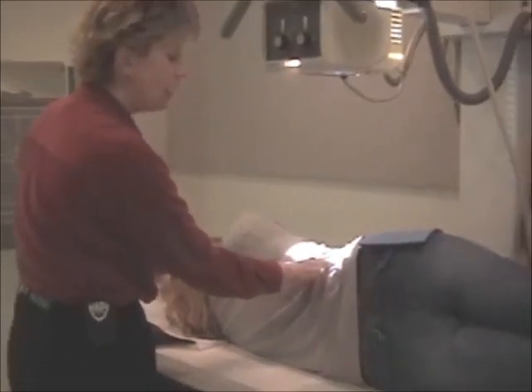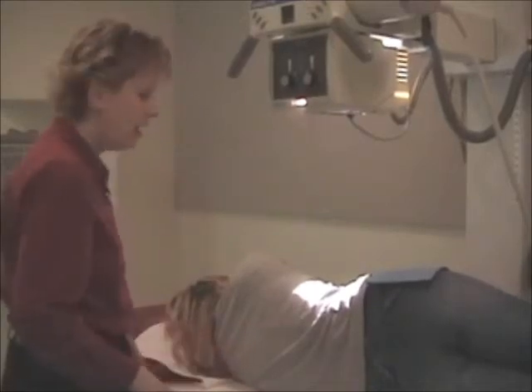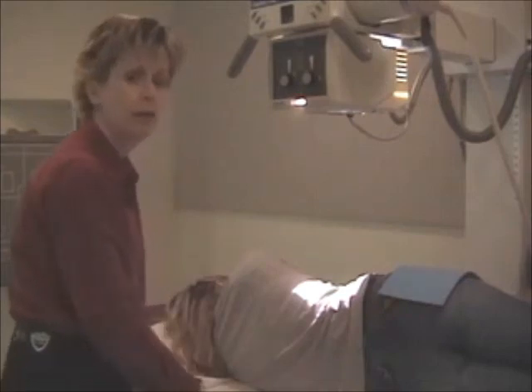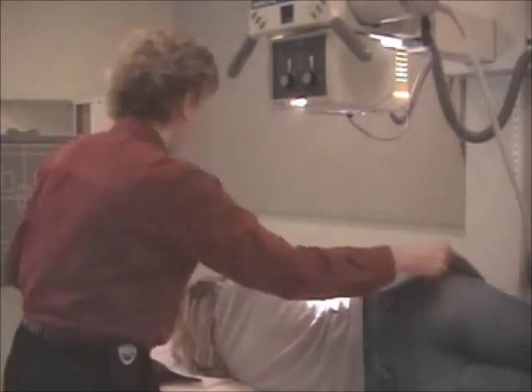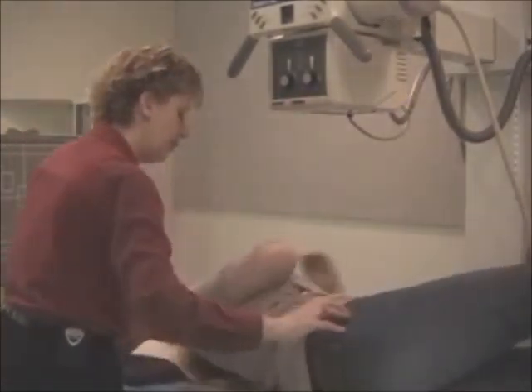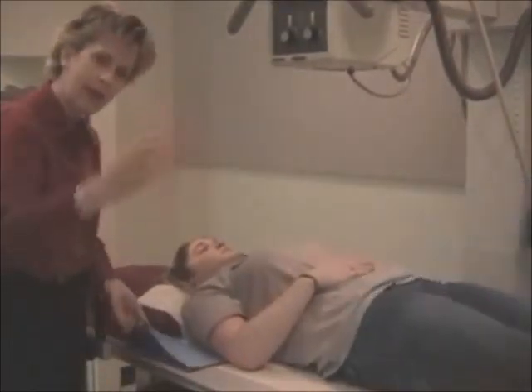And little tiny are your 80, 90-pound little old men and little old ladies, where there's no muscle tone and everything shifts down. I've actually taken an x-ray of a stomach that was entirely in the pelvis because of muscle tone. Everything just drops. Okay. Kristen, I'll have you turn onto your back. There you go. Notice we're having her go in one direction. I don't want her tipping back and forth.